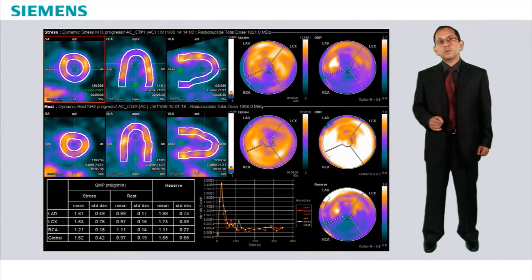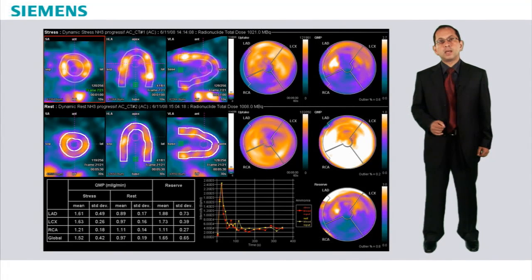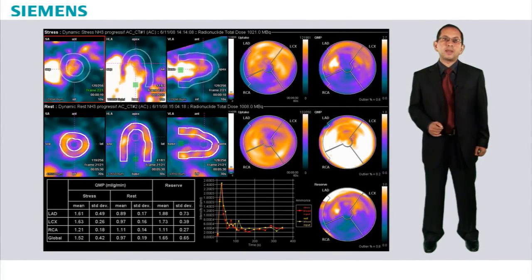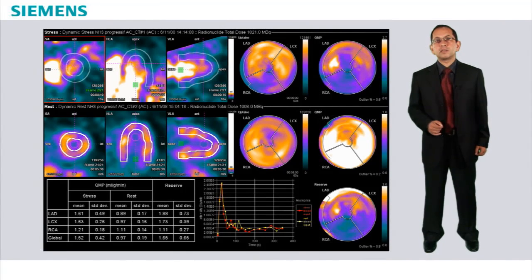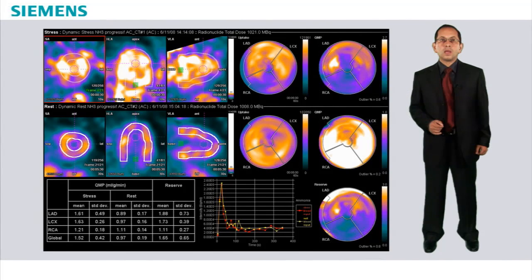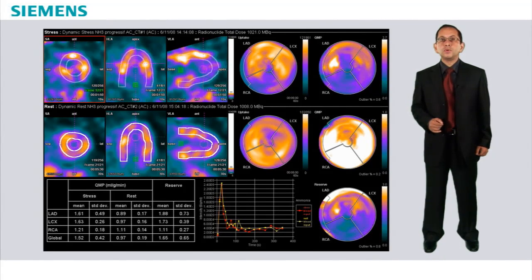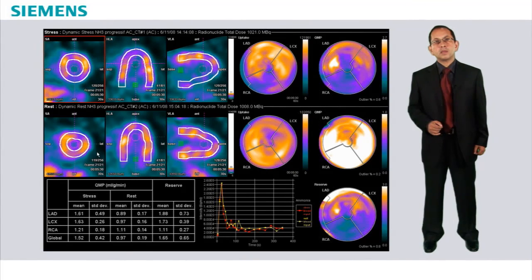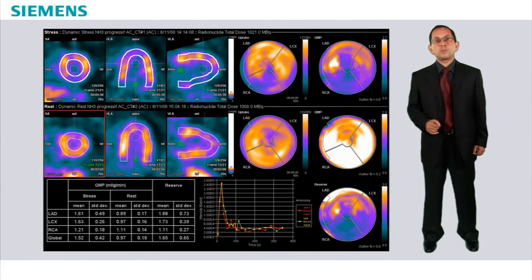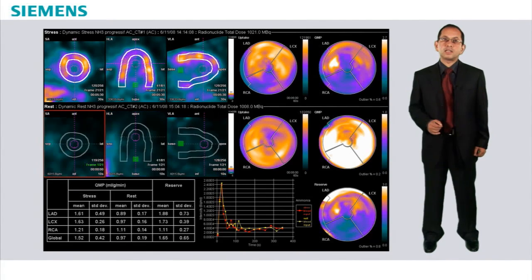We can also see the adequacy of the bolus by looking at the individual dynamic frames. Here we see the initial tracer transit in the right ventricle, then the left ventricle. Over the next frames we see the gradual diffusion of the tracer into the left ventricular myocardium. The individual frames can likewise be checked in the resting study.